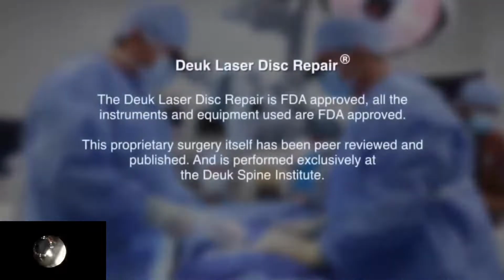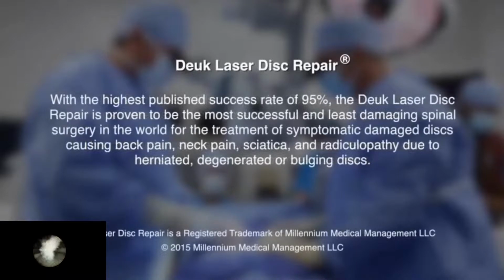The Deuk laser disc repair is FDA approved. All the instruments and equipment used are FDA approved. This proprietary surgery itself has been peer-reviewed and published and is performed exclusively at the Deuk Spine Institute. With the highest published success rate of 95%, the Deuk laser disc repair is proven to be the most successful and least damaging spinal surgery in the world for the treatment of symptomatic damaged discs causing back pain, neck pain, sciatica, and radiculopathy due to herniated, degenerated, or bulging discs.